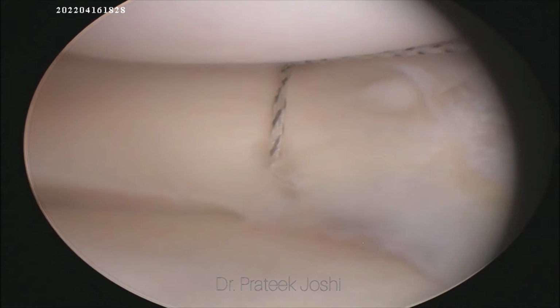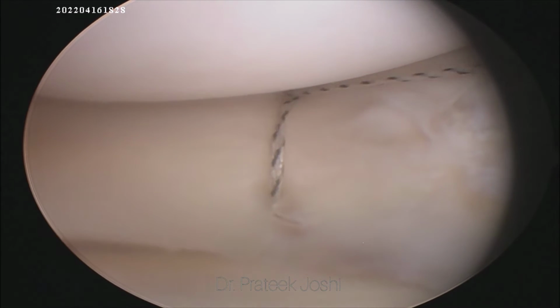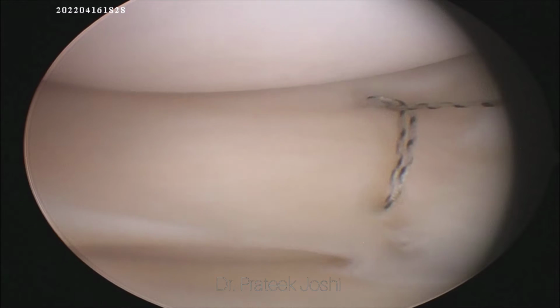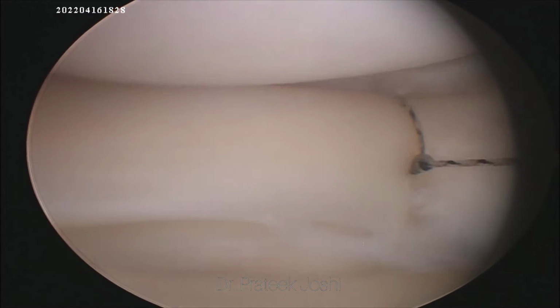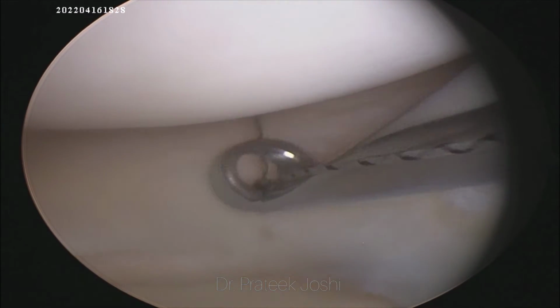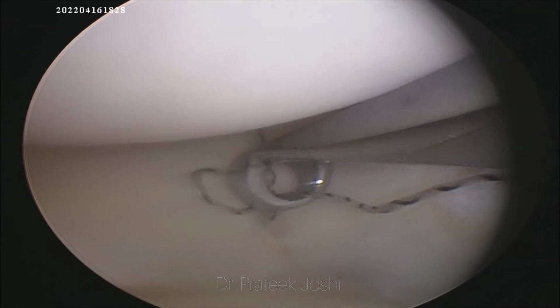So we have deployed the second implant, and now we are going to withdraw the all inside device, and now we are going to gently pull the thread, and this is going to reduce the longitudinal tear. So now we are going to push the knot and cut the knot flush.